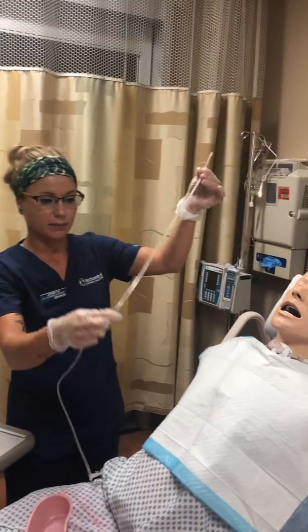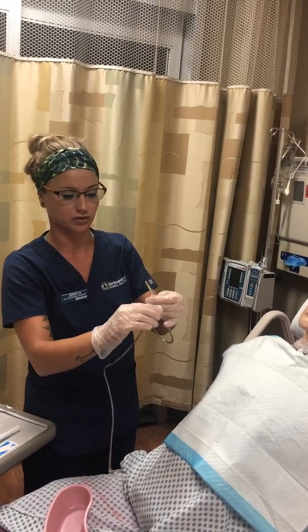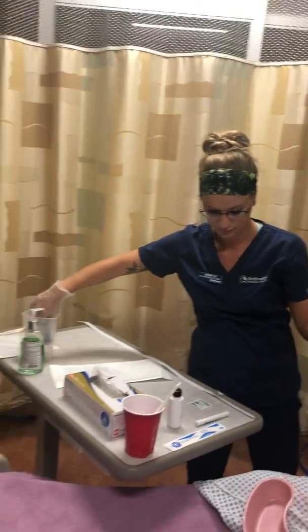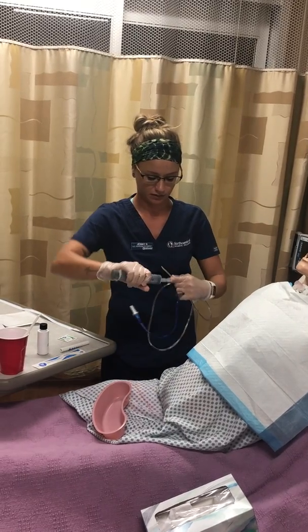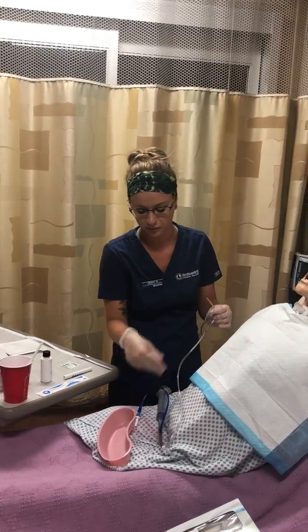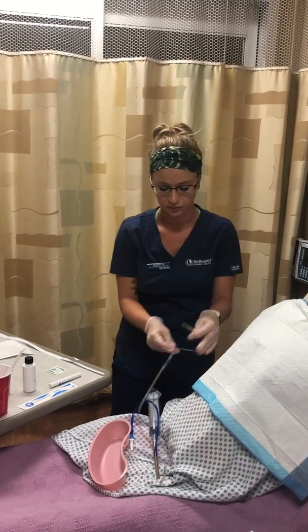So my tube happens to have nice markings here, and it's hitting the 50 mark, but you can also add a piece of tape so you know when to stop inserting. Okay. And I'm going to connect my syringe in case there's any aspiration of stomach contents. I also applied a safety pin with a piece of tape to attach it to her gown once it's inserted.